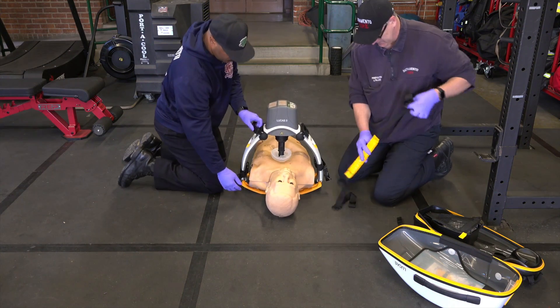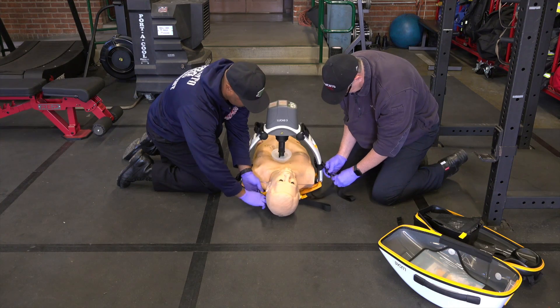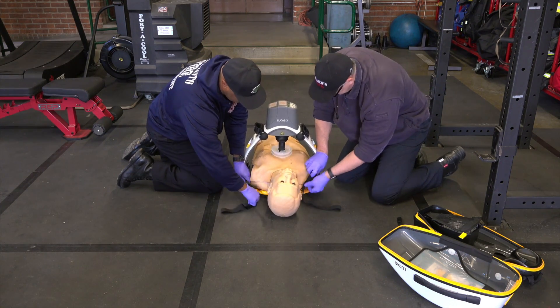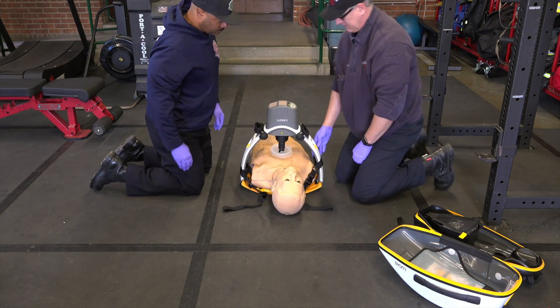Now lowering the cup down and activating the device in 30 to 2 mode — the device begins to deliver compressions. They slide the shoulder strap underneath the patient, attach it to both clips, tighten down, and literally just that fast, CPR is underway.